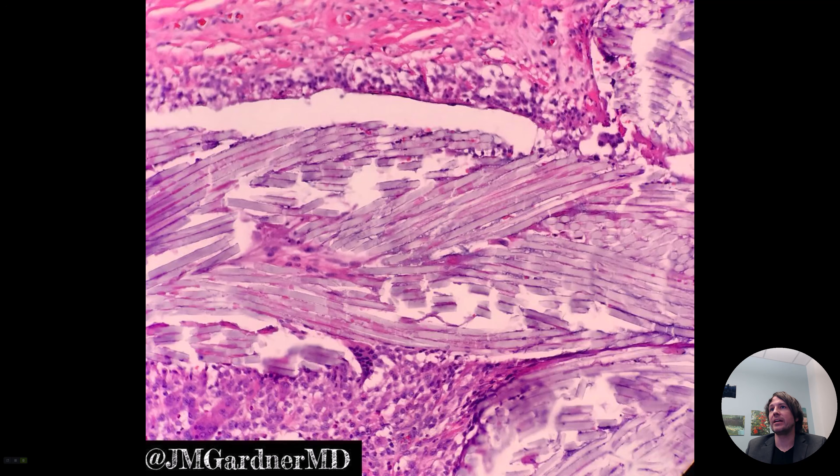It doesn't seem very exciting right here, right? If you've not seen this before, you might not know what this is. This is a skin excision specimen that had been excised previously — I think it was melanoma or some sort of skin cancer and the margins were positive. So they went back and re-excised the area and we found this in the excision specimen.